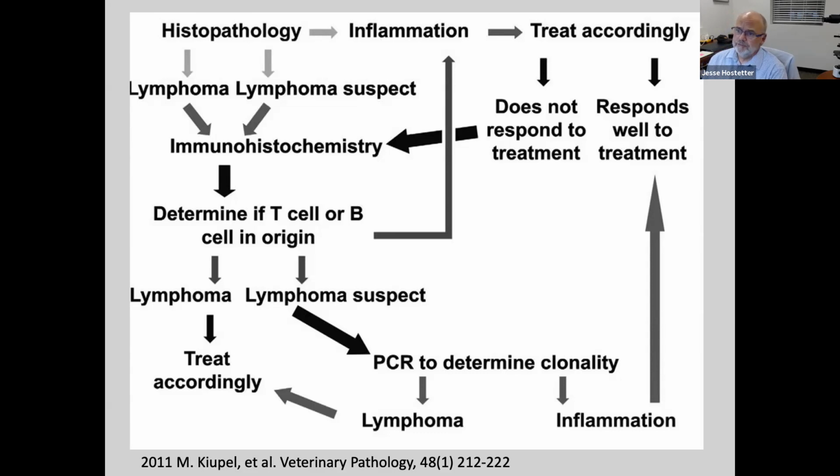I've been part of a few different studies where we have measured crypt villus ratios in different settings, in inflammation, in homeostasis, and under different nutritional planes. And I find with morphometry that is a really hard question to answer. So where I've come to in my practice, Kathy, is that I don't try and do it for individual cases. I'd rather assess villus blunting by looking across different sections and seeing if I can convince myself that there is a stubbiness or a blunting and fusion of those villi. I hope that answers your question. It's a difficult question to answer.